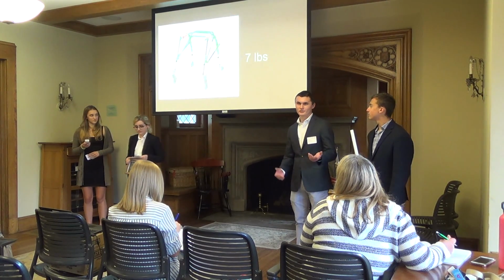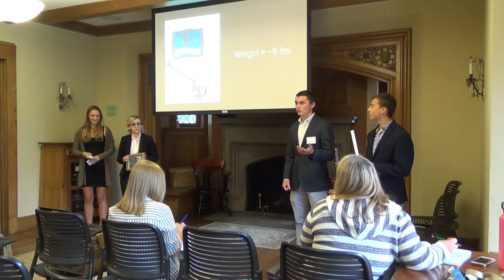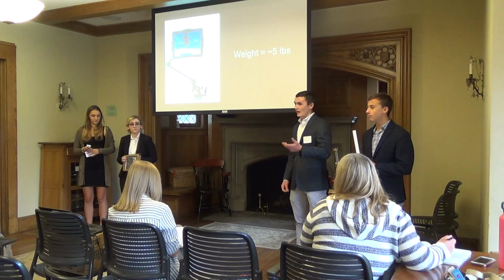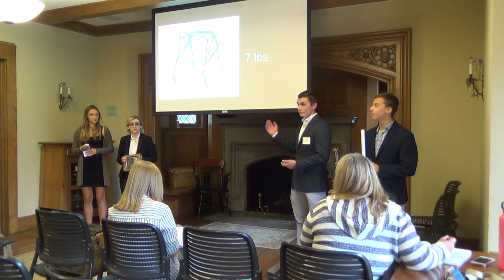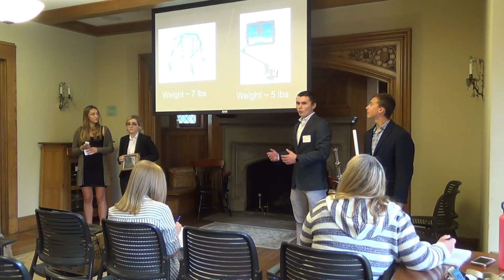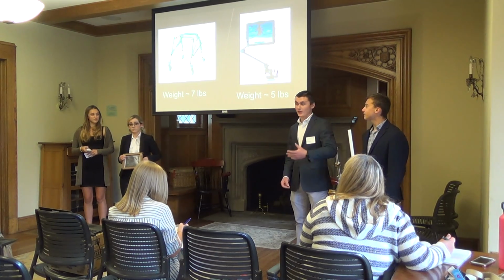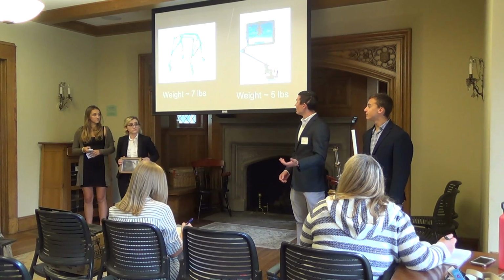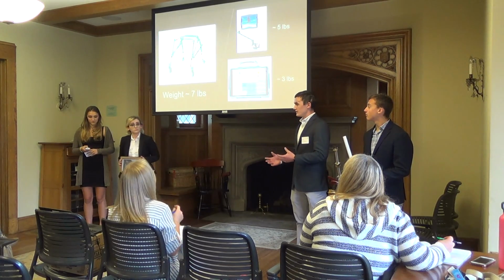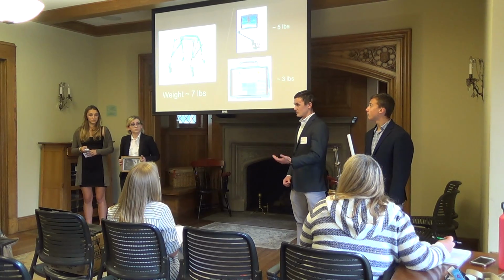Now, this probably doesn't seem like too big a deal to all you parents in the audience, but considering that a lot of the vehicles that people with CP use, like walkers and strollers, are not actually that heavy. As a matter of fact, the lightest one is 7 pounds. And so attaching a mount that sticks out from the side of it gives it the high potential to tip over and potentially break the device that the mount is holding. So one of our big goals was to design one of these mounts that was light enough so that the walkers and strollers wouldn't tip over when it's attached to it.